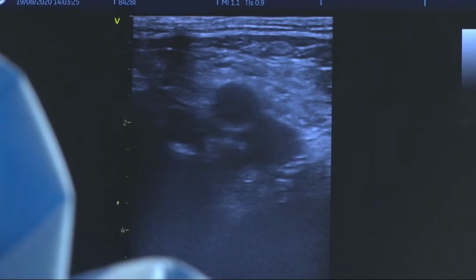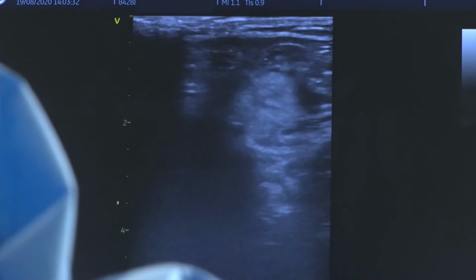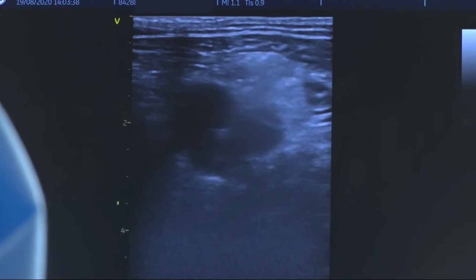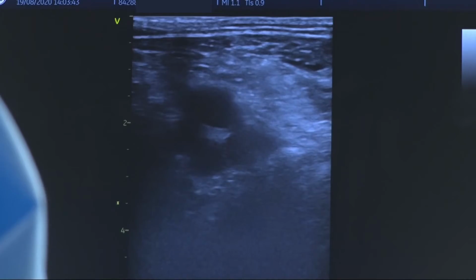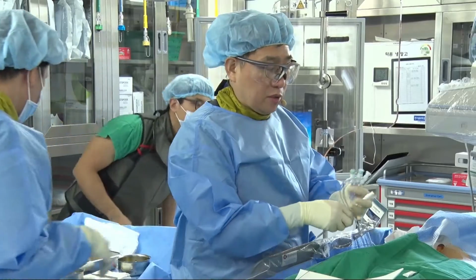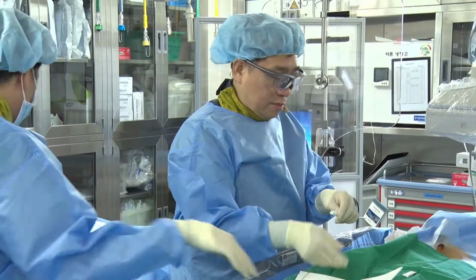It's quite easy. So we are using two venous punctures: we use 14 French tripod sheaths in one, and the other puncture is for the transseptal long sheath. So just two punctures is our standard ablation access. We are using 14 French tripod sheaths. You can put 3 mapping catheters through this sheath. So that's why we are using just 2 punctures.